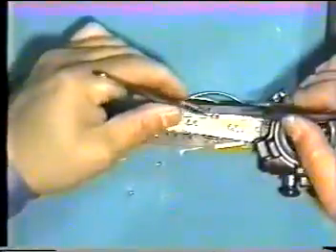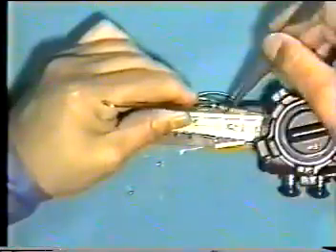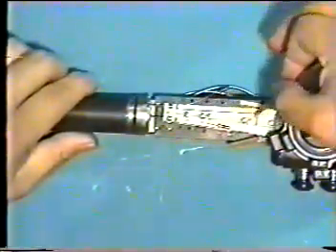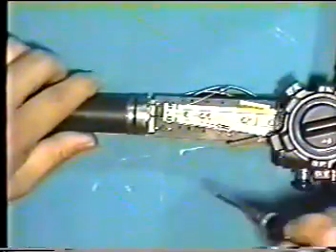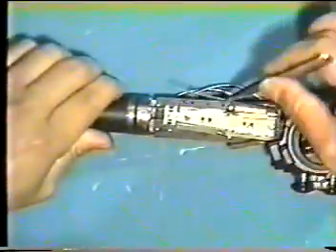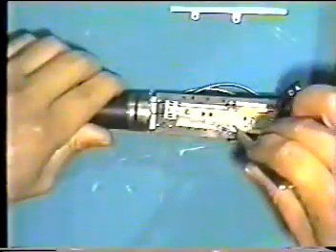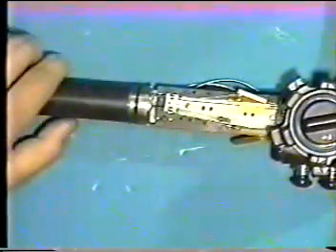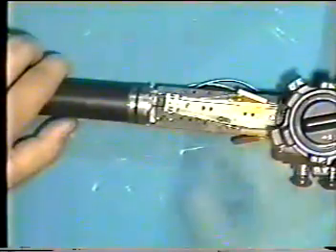Turn the sleeves of up-down and right-left wires to be disconnected from the drum wire assembly. In case of turning the sleeve, make sure to pull out wires towards you as little as possible. Next procedure is to remove the plate upside and another one downside. Each angulation wire and the drum wire assembly can be separated through these procedures.